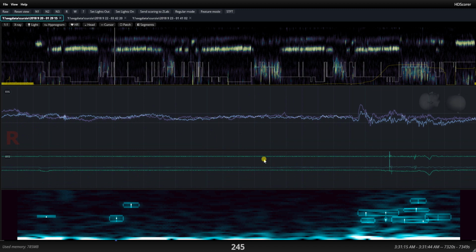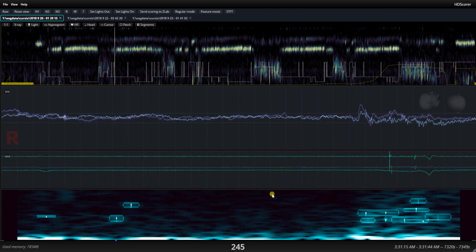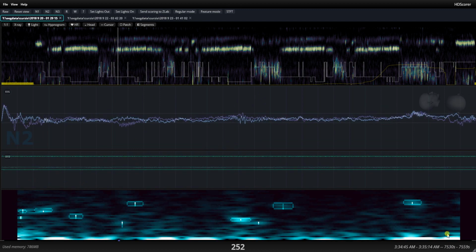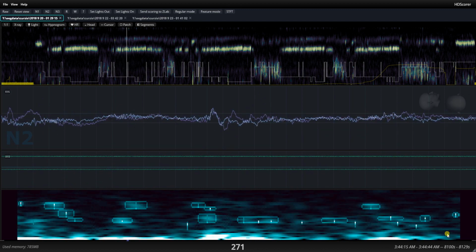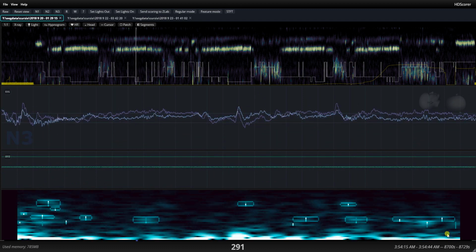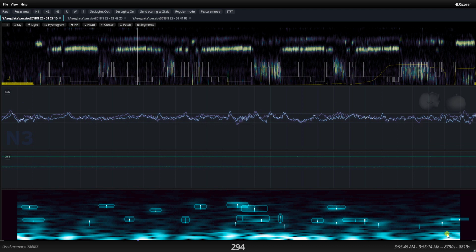And then you have another major body movement with alpha waves, I see from the spectrogram up here, which I think is visible over here in the short time Fourier transform. Anyway, let's get past this phase, just making sure that we don't have any N3 activity because it's all being scored as N2. The threshold is put right here. Here is when the algorithm thinks that we're going into N3.